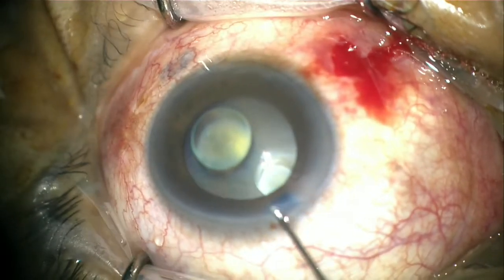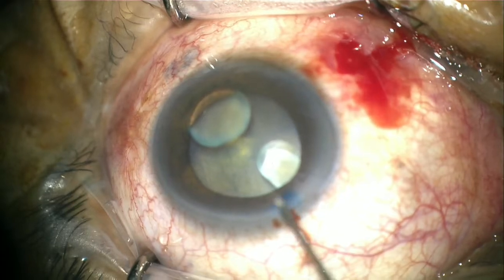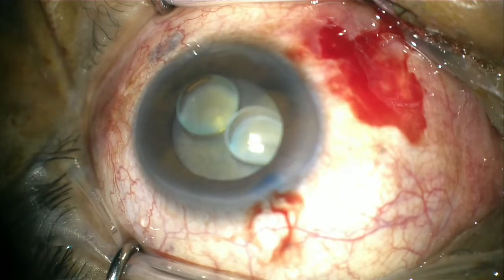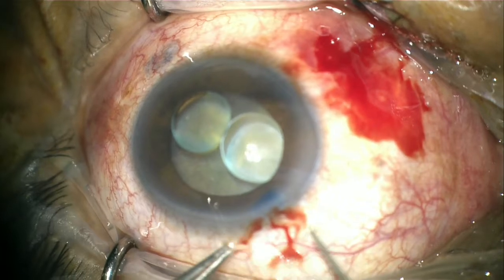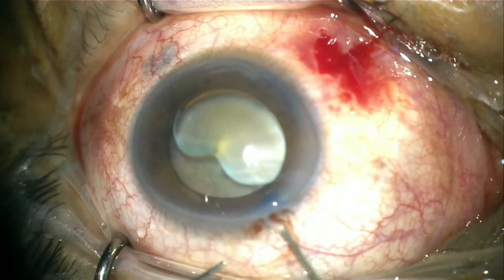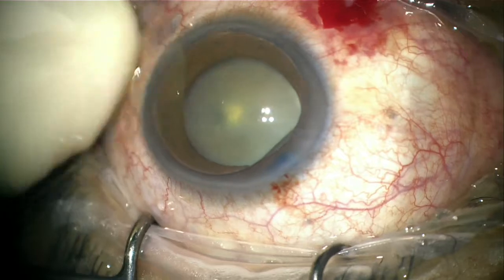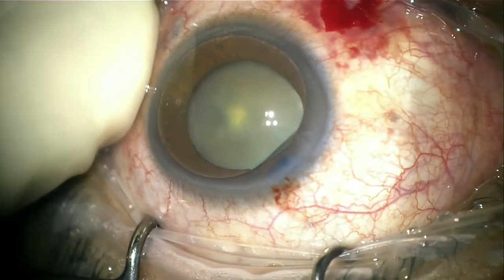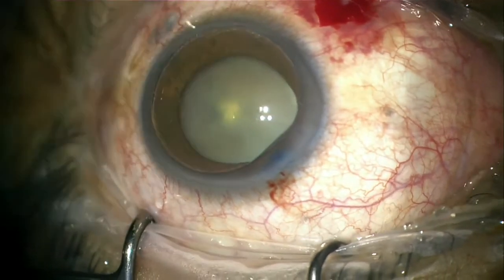But how? The chances of more and more oil coming forward is very likely without any intervention. As we can see, digitally the eyeball felt very soft. Losing more and more heavy oil from the vitreous cavity will further make the surgery more difficult.